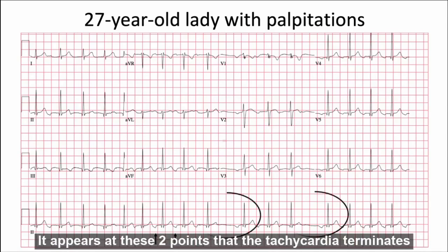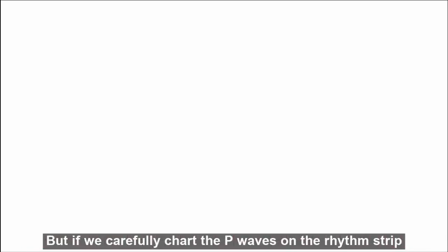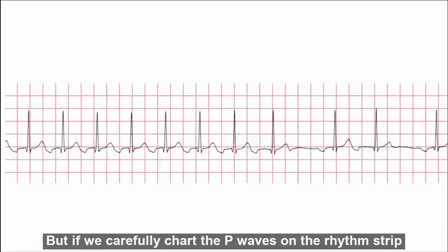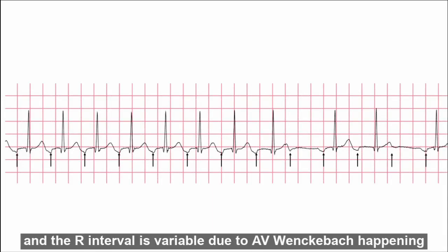It appears at two points that the tachycardia terminates and restarts again. But if we carefully chart the P waves on the rhythm strip, we can see that the tachycardia did not terminate and the RR interval is variable.